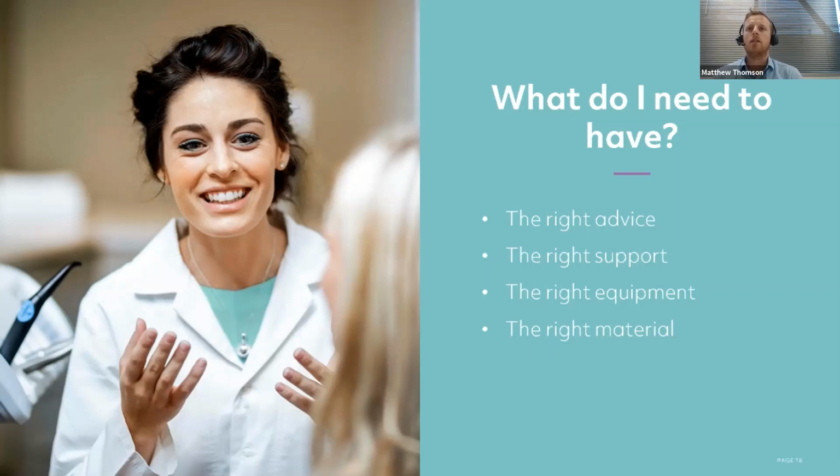Of course, we said you need to have the right TGA approved materials. If you're going to put this in someone's mouth, then it has to have TGA approval, or MedSafe in New Zealand, or whichever regulatory body is in your country. And these questions are something we can help with. So if you do have any questions, please do reach out. So we'll move on to the next slide now.